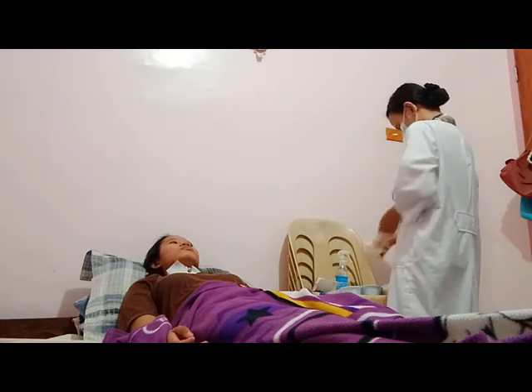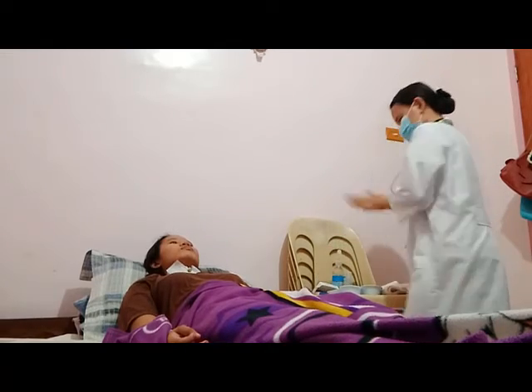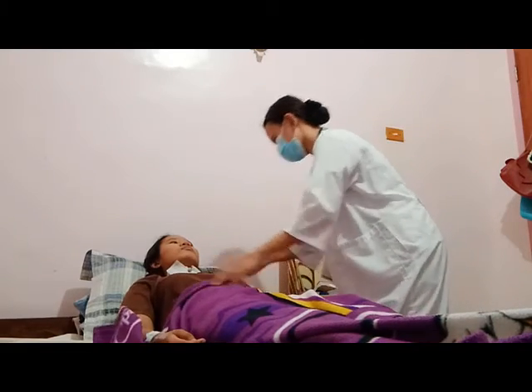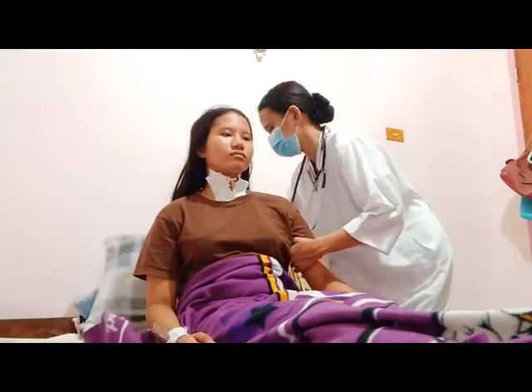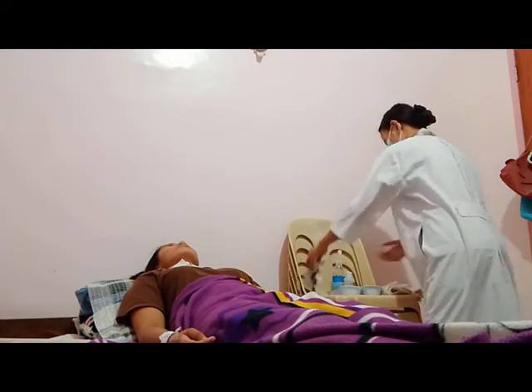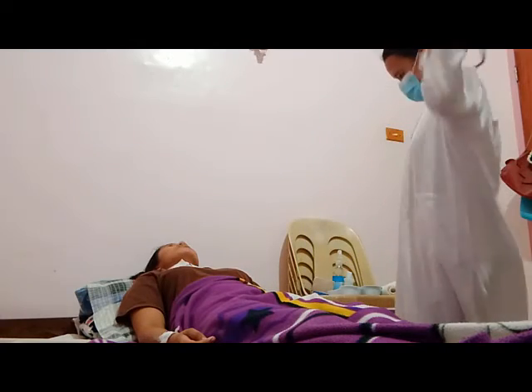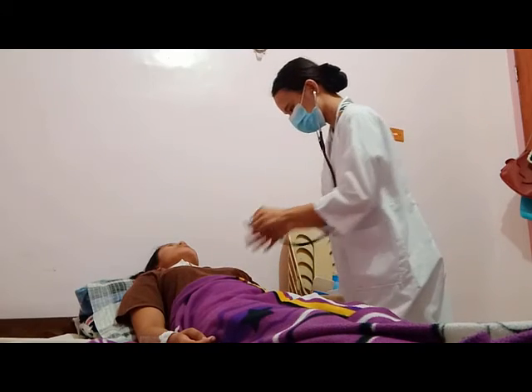Remove gloves. Assist the patient to a comfortable position. Raise the bed rail and place the bed in the lowest position. Remove additional PPE if used. Perform hand hygiene and documentation. Reassess the patient's respiratory status, including respiratory rate, effort, oxygen saturation, and lung sounds.